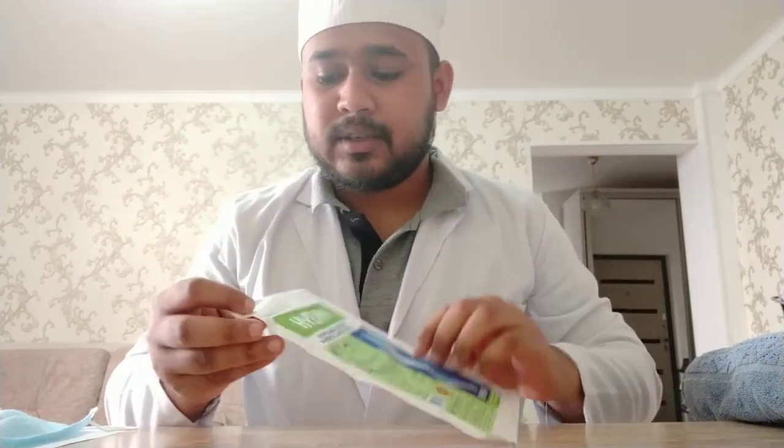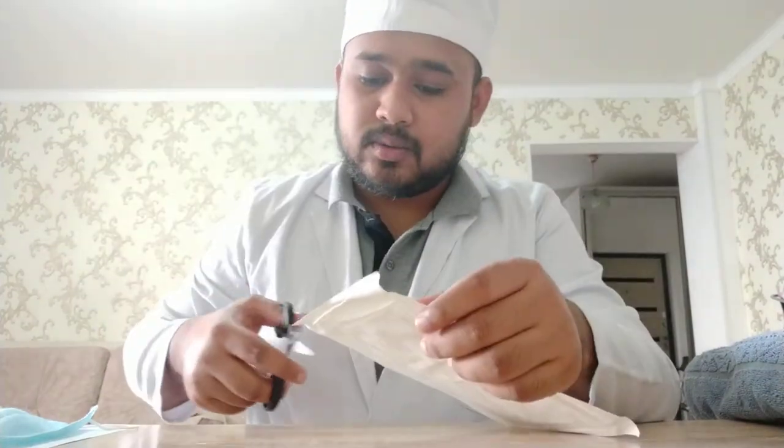Hi, myself Father Dinh Ahmed and I am from group number 389. Now I will demonstrate how to put on sterile gloves. First of all, you need to cut the packet.